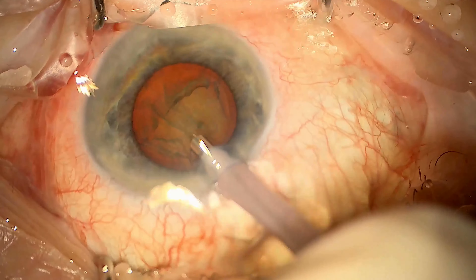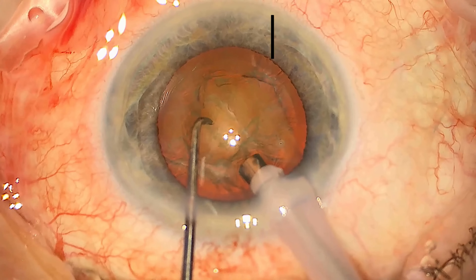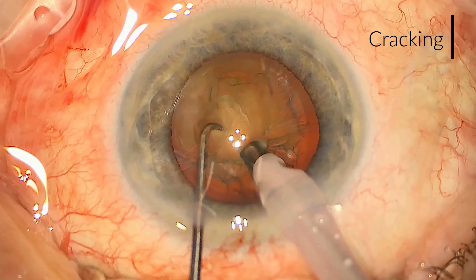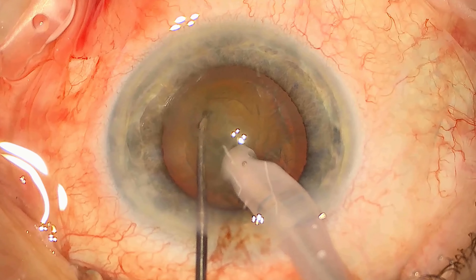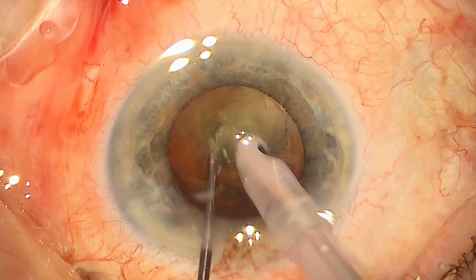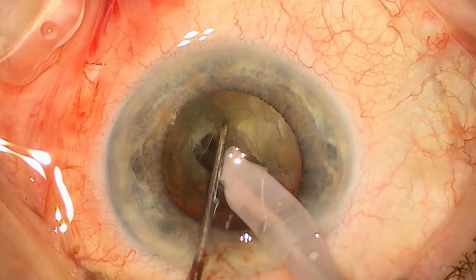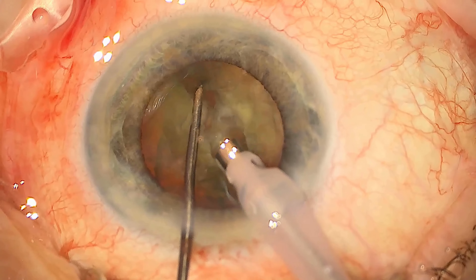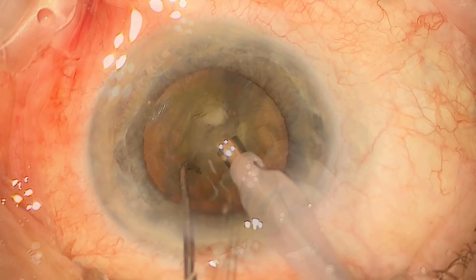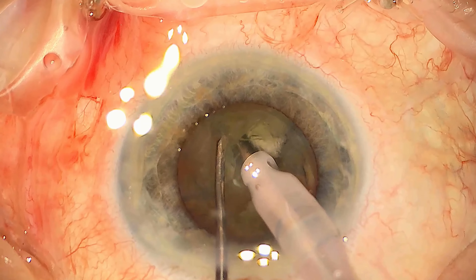Now using a combination of ultrasound energy, which is produced in this probe here, and mechanical chopping to break the lens down into smaller pieces and remove them bit by bit. There are many different ways of doing this but this is a primary chop technique. You can then rotate the lens around and embed the probe into the nucleus to crack it into smaller pieces.